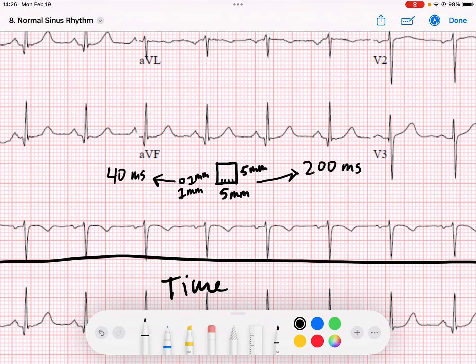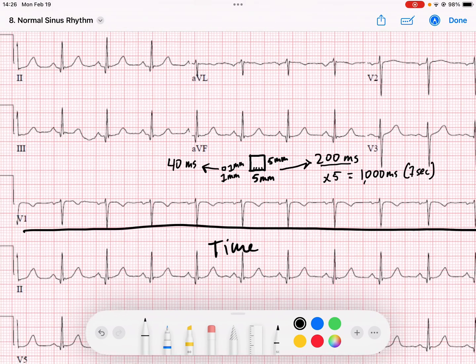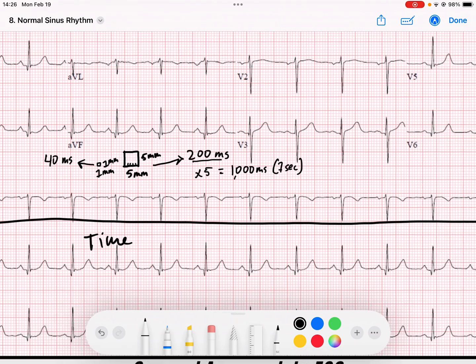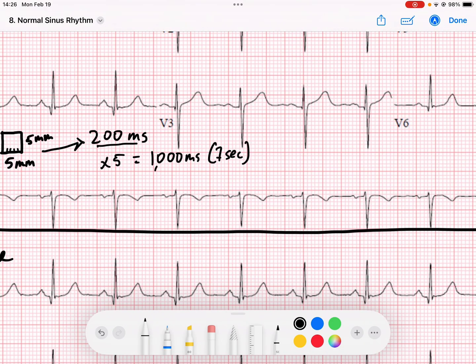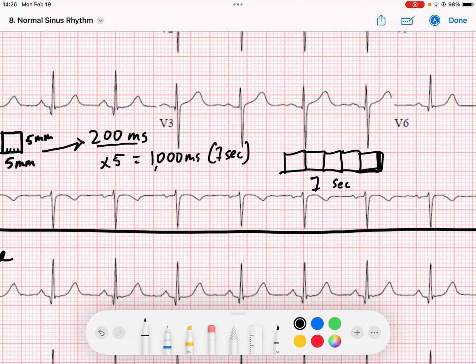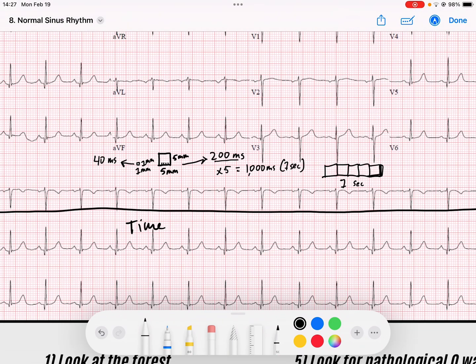So those are our basic units. If one big box is 200 milliseconds and we put five of those together - multiply that by five - we get 1,000 milliseconds or one second. So five big boxes - one, two, three, four, five - represents one second. That's the idea of the timing.